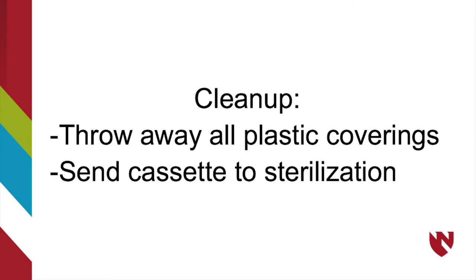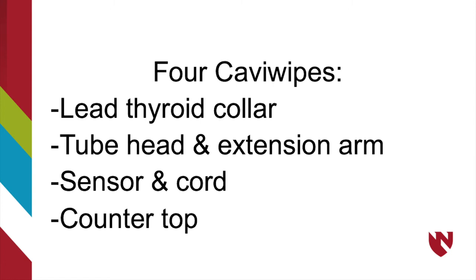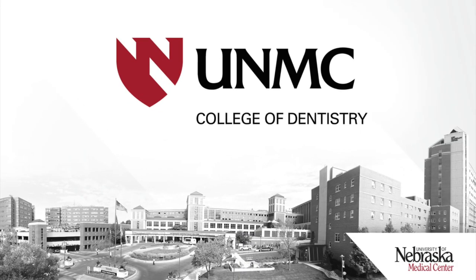For cleanup, throw away all plastic coverings. Place all autoclavable materials in a cassette and send them to sterilization. Use 4 Cavi-wipes and wipe down the lead thyroid collar, x-ray tube head and extension arm, and sensor with attached cord and the countertop. That completes the process of taking both mandibular premolar and molar periapical radiographs.